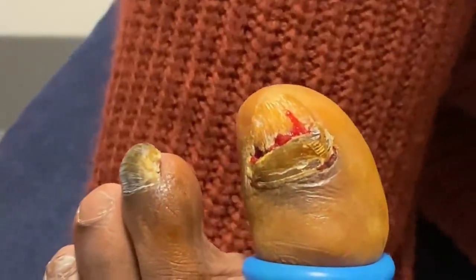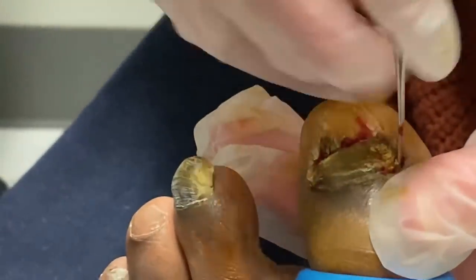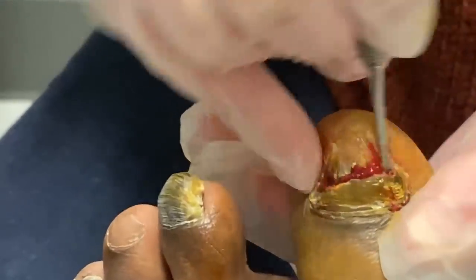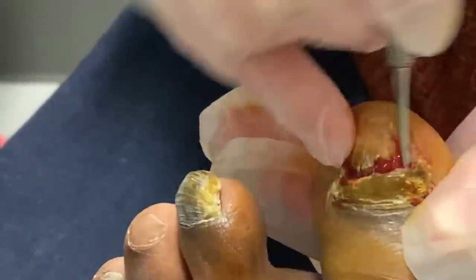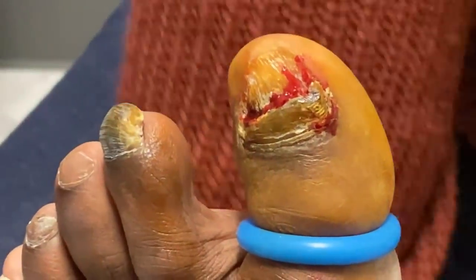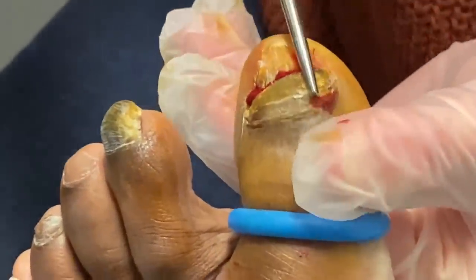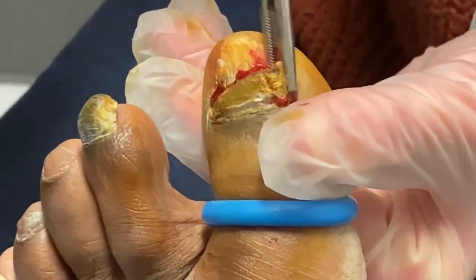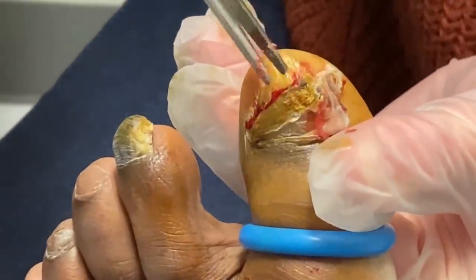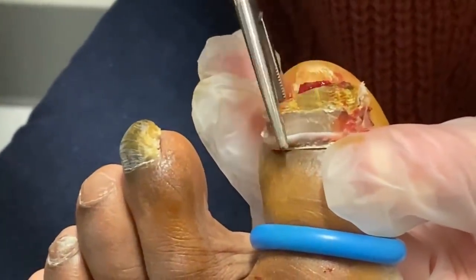It's not quite loose yet. There you go. It's real deep. Get that out of this side. That's pretty cool.